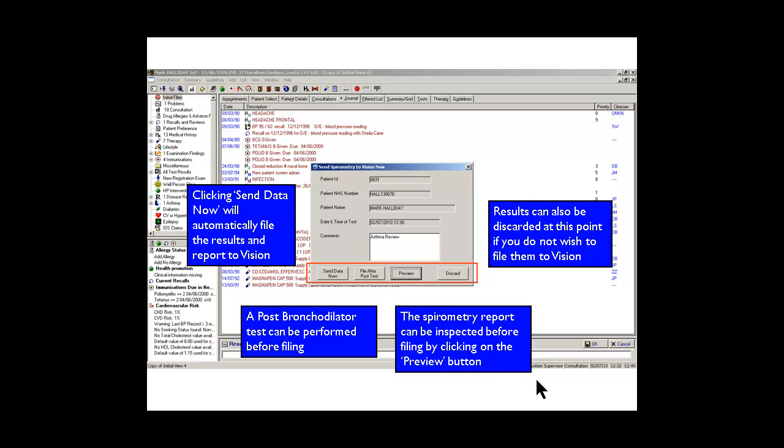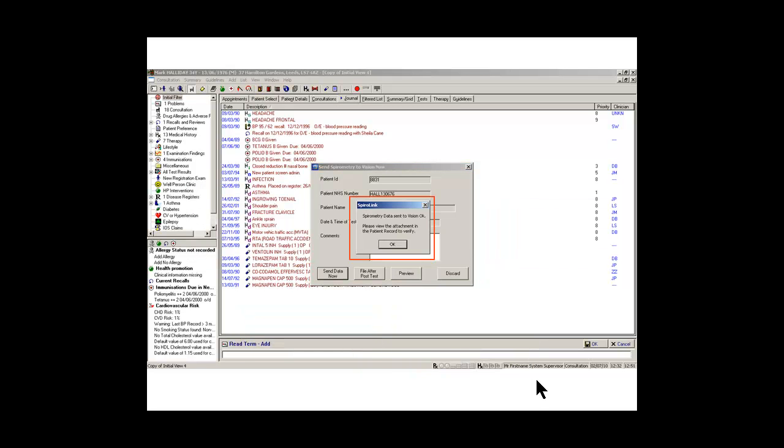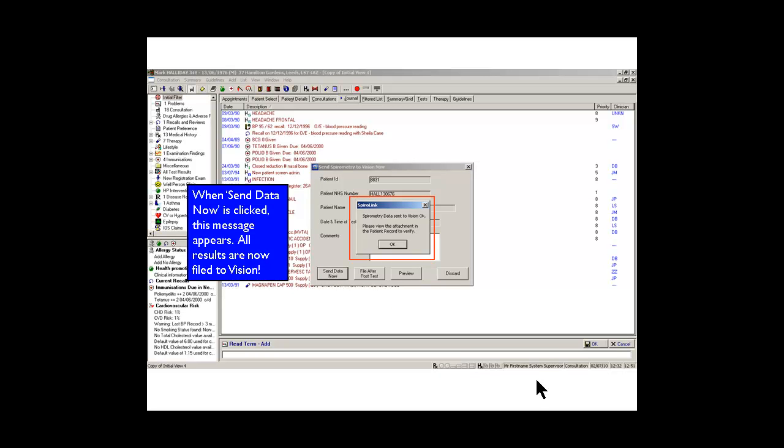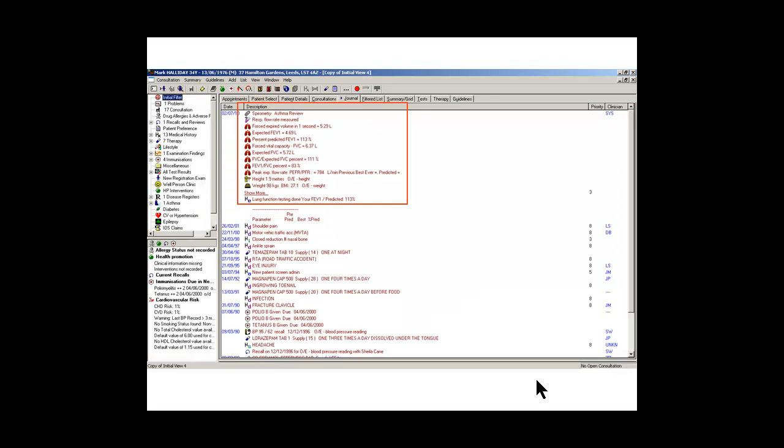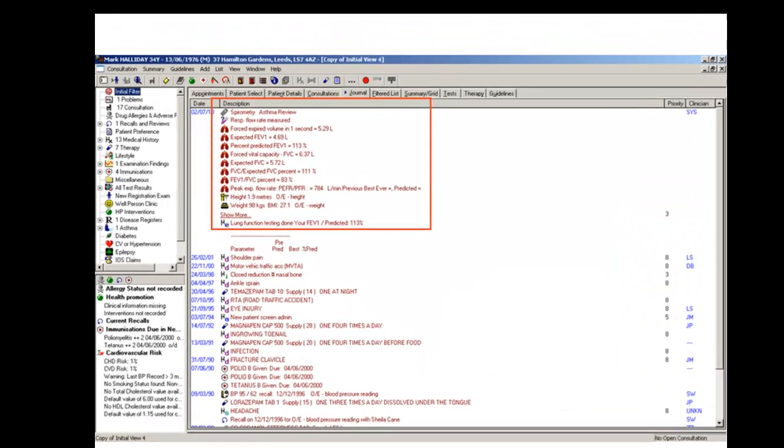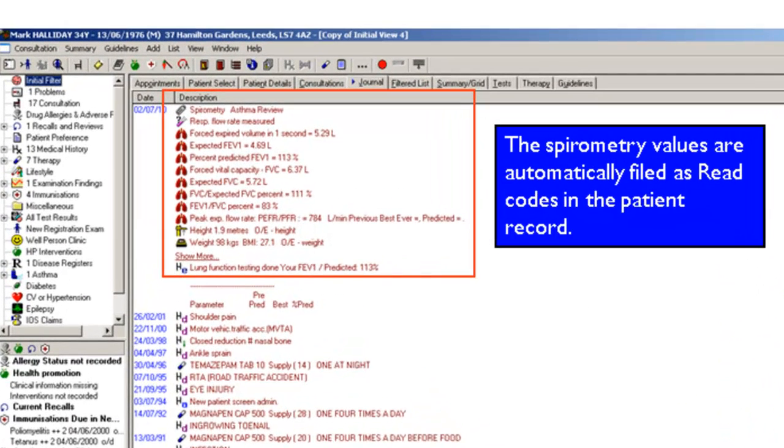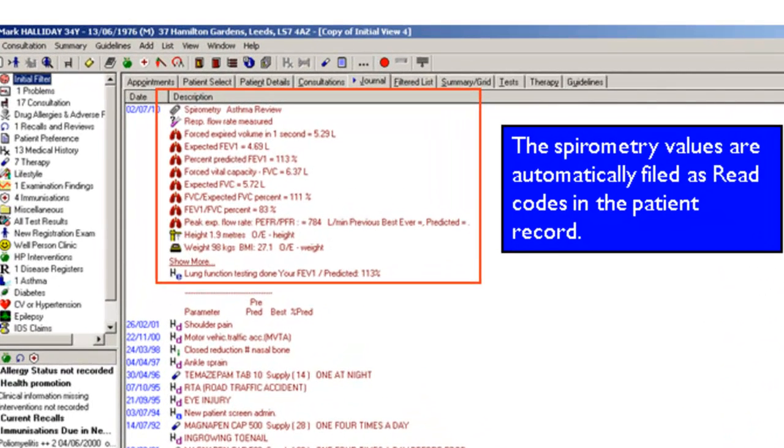However, we send data now to the record. It tells us that the data has been sent to Vision OK and we can view the attachments in the patient record. All of the data has been placed onto the record automatically and read coded.